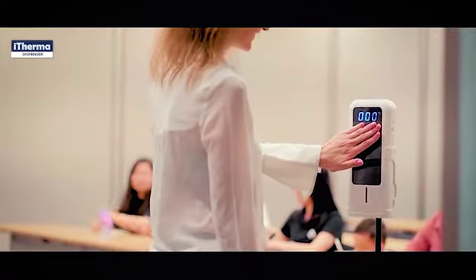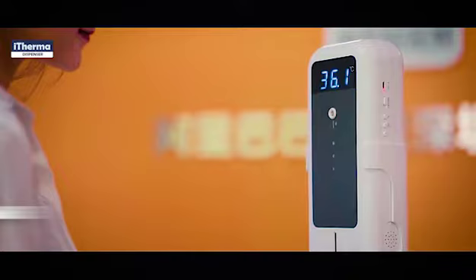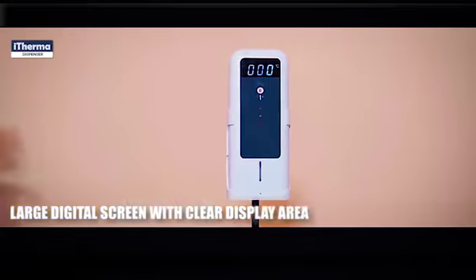Ideal for offices, hotels, schools, and high traffic locations. Features a large digital screen with a clear display area.